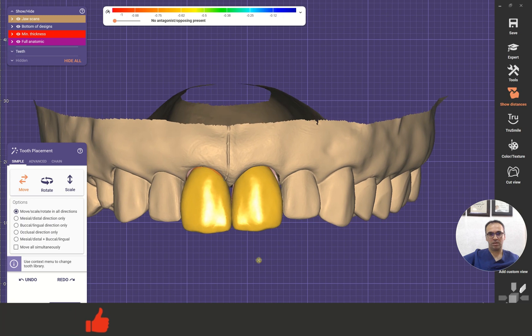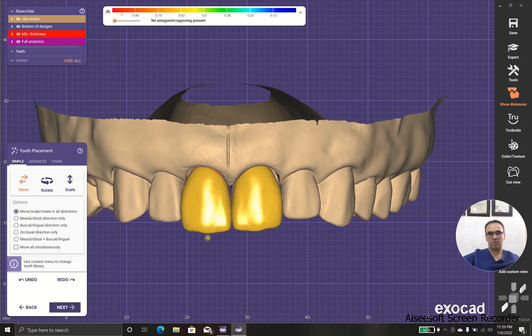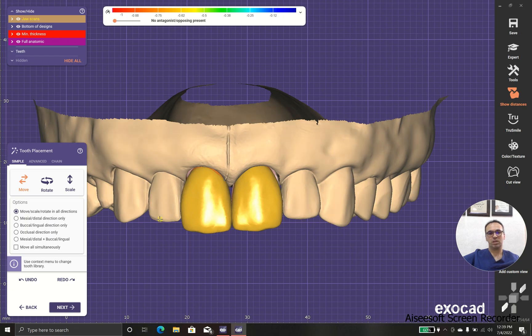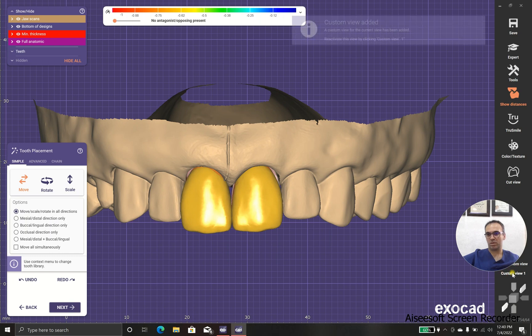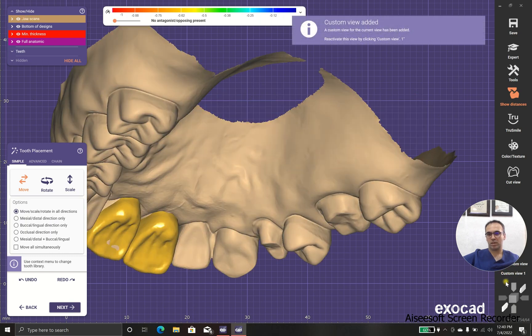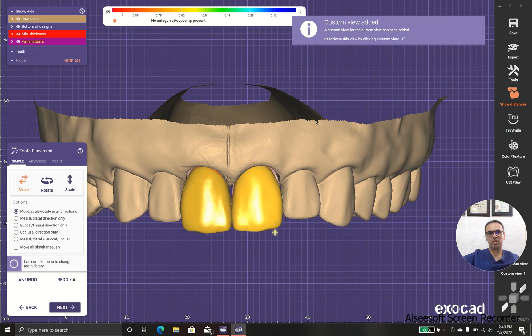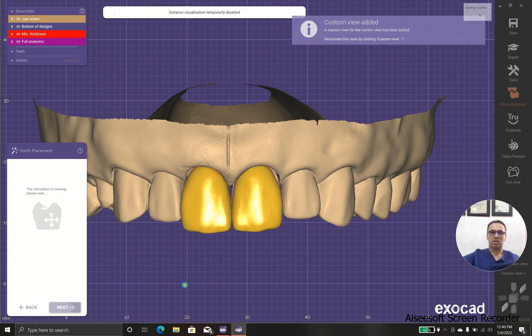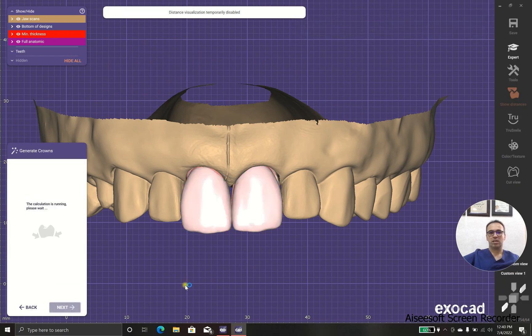I use something in between — between the lateral incisor and canine. This incisor is one millimeter upper line and the canine is one millimeter down. This one is almost flat. I put this in the proper position and I add a custom view, so when I want to go back to this position, it gives me the exact result as it should be.